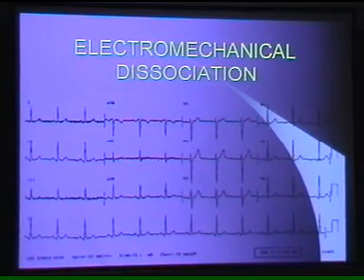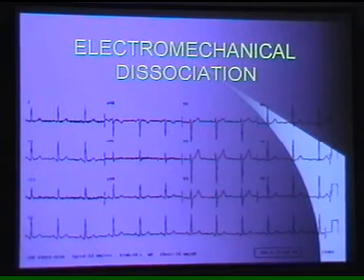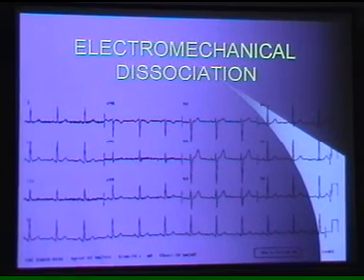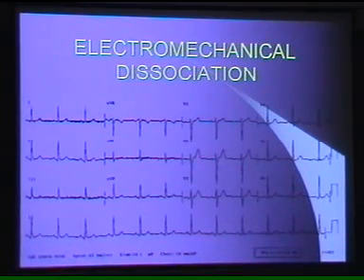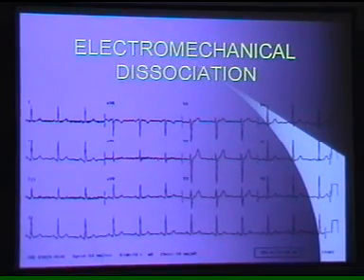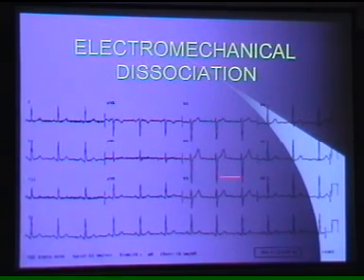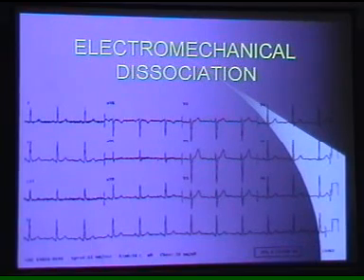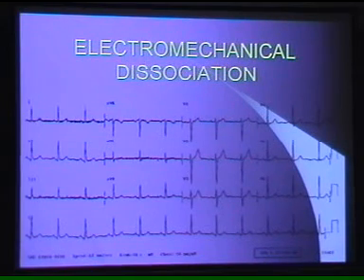And lastly, I mentioned that in the treatment of a person who is having advanced cardiac life support, we mandatorily require ECG monitoring to detect what is the underlying rhythm disturbance and treat that. As I mentioned, in the majority of cases that would be ventricular fibrillation, but sometimes what we find is that the ECG may appear to be quite normal. Here is a normal ECG, and yet the person had no cardiac beat or effective cardiac output.